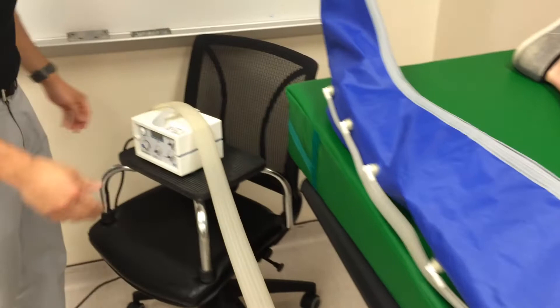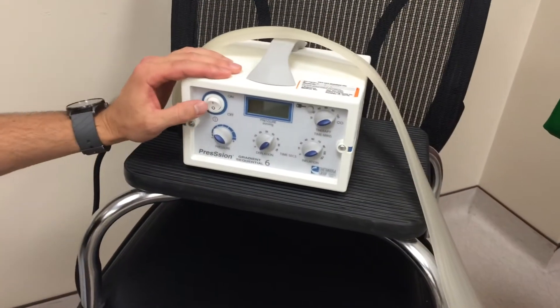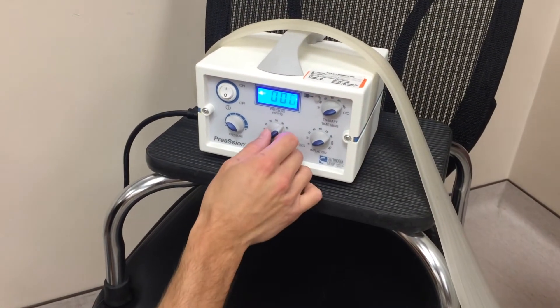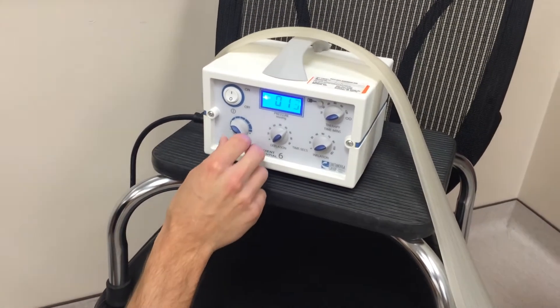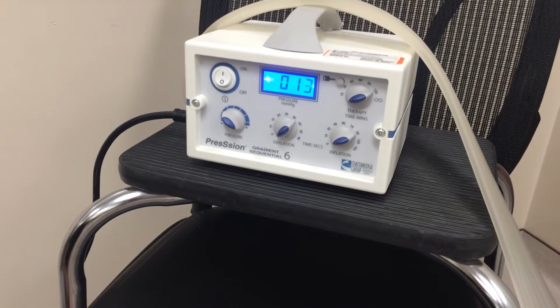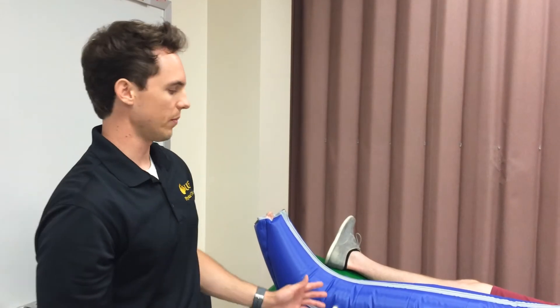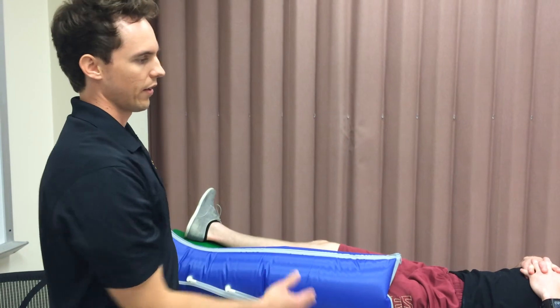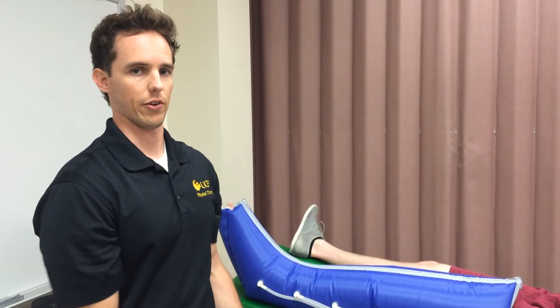Make sure that's tight. We've already checked all the valves to make sure they're correctly applied. Check the connection again at the machine. Now that we're all set up, we can go ahead and turn the machine on. Again, we have 90 and 30 — our 3 to 1 ratio of inflation to deflation time. Our pressure is going to be between 40 and 80 millimeters of mercury, starting at 40 for the first treatment. After we've begun the treatment, I'm basically going to reassess patient comfort. He's okay right now. I'm also going to leave him with a call bell just in case he has any adverse effects during the course of the treatment, as it is a two to three hour treatment.